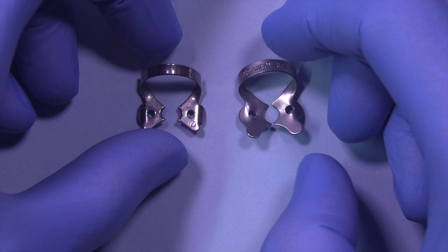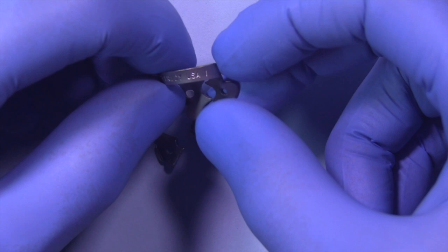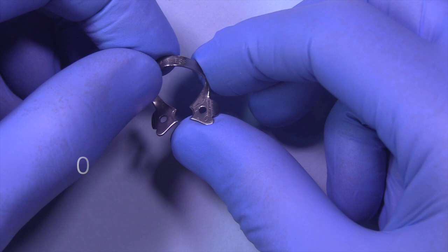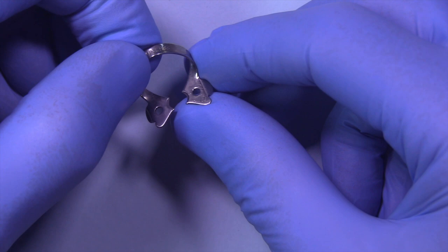Now here are the winged clamps. I've got two here — one is a number zero and one is a number one. These have wings which help to stabilize the rubber dam from riding up along the side of the tooth. Some operators choose to place the clamp in the hole and place the clamp and the rubber dam simultaneously. I don't actually like to do it that way — I like to place the clamp first and then place the rubber dam on top of that.